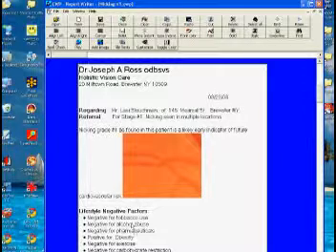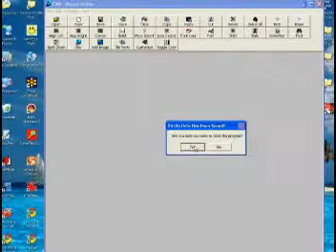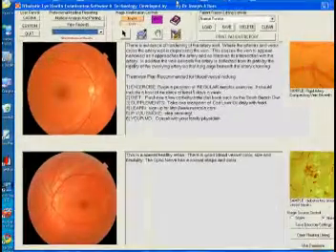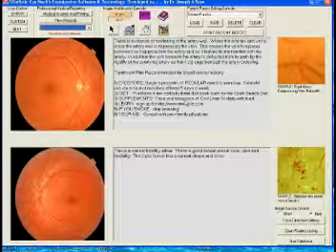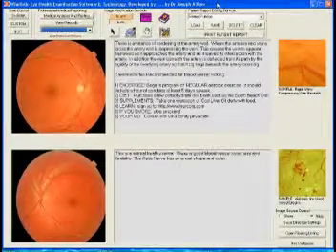If you follow this and you send reports to the doctor and you give the patient the information that they need, guess what? You're going to see very significant growth in your practice, and you're going to be providing a great service. This is what digital retinal imaging is all about. It takes just a few moments. It utilizes the tools you may already have in your office. I hope you have a digital camera. If not, you need one. And get one, because the program paid for it in 6 months.